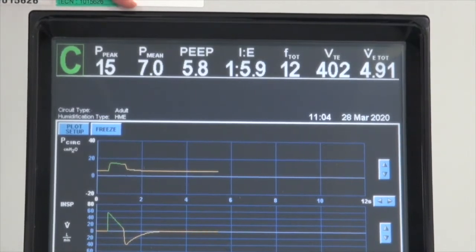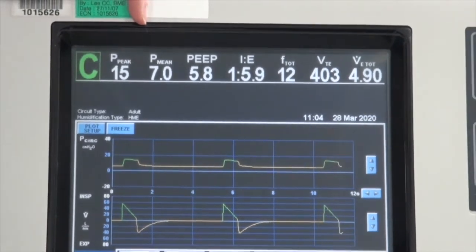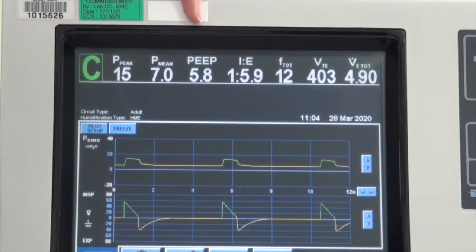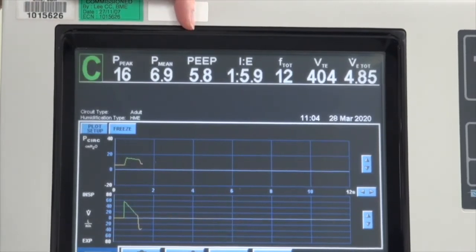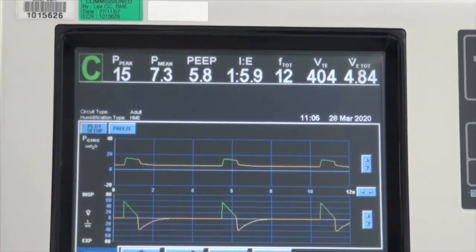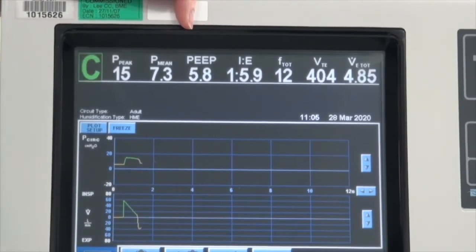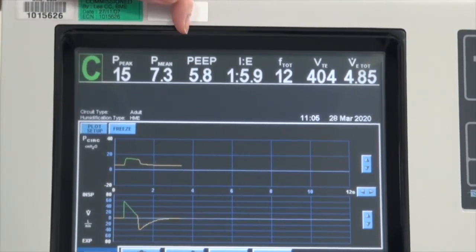The third reading is the mean airway pressure. Usual monitoring is not as critical, but it tells you the average pressure in the airway system. The next reading is the calculated or measured PEEP, which is usually very close to the set PEEP. However, in certain patients with air trapping and auto-PEEP, these numbers could be much higher, potentially giving you a warning that the patient may have auto-PEEP.